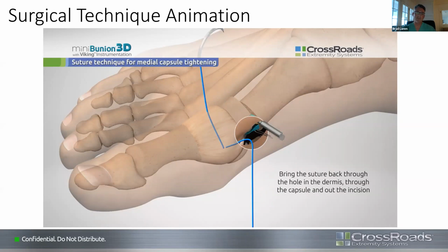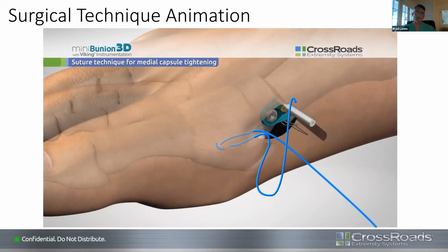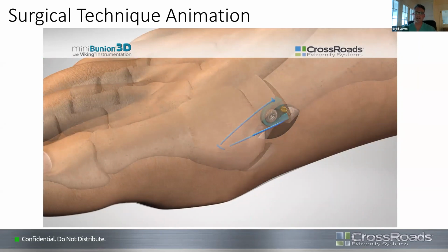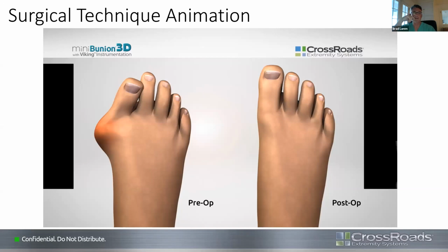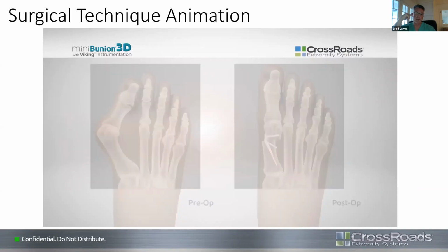What you want to do is just grab the medial capsule, pull it towards the implant, and then pull this through from plantar to dorsal. It gives you a nice anchor proximally, and then you can dial in the amount of medial capsular correction you want if you desire that. It's surgeon preference, but it is available with this implant. And then a small closure of the skin. And here's a pre and post-op example of what it looks like.